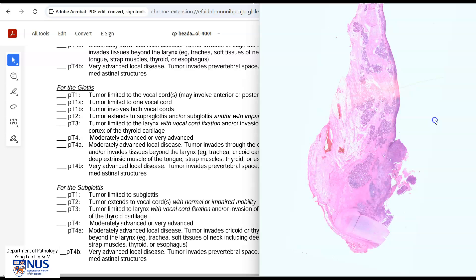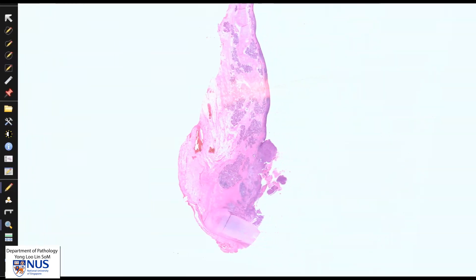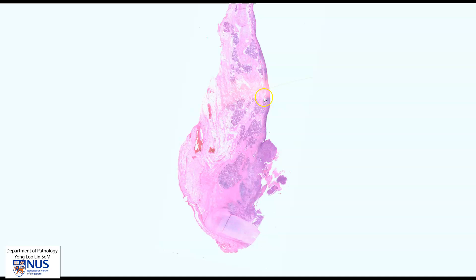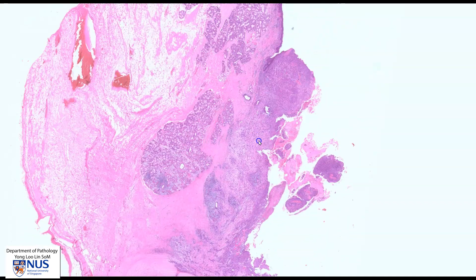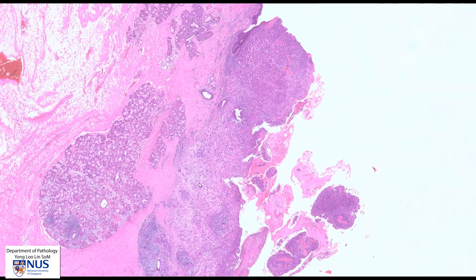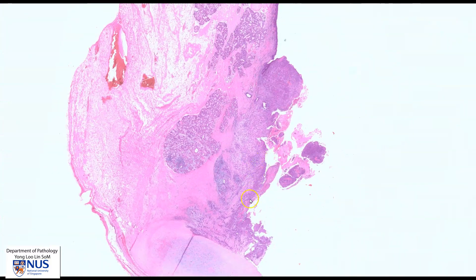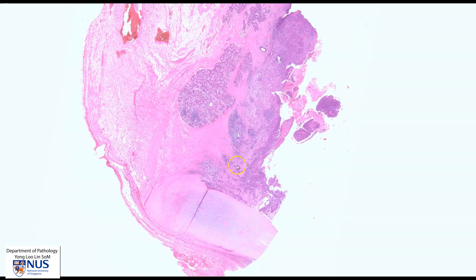So this is how the pathologist would generally evaluate the tumor in terms of the grade of the squamous cell carcinoma — in this case, poorly differentiated — and also the location of the tumor, whether it is involving one or more sites of the larynx, and the local extent of spread, for example, whether it's going into the thyroid cartilage or adjacent structures.